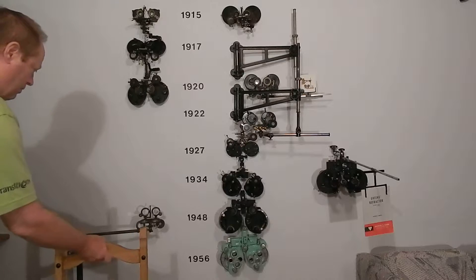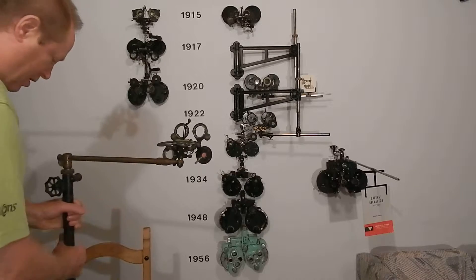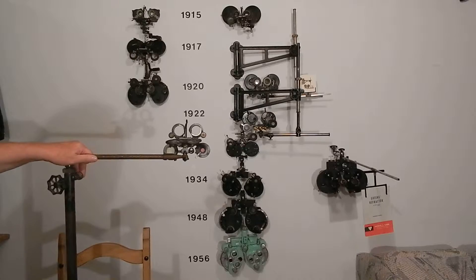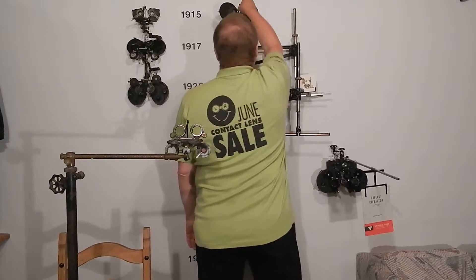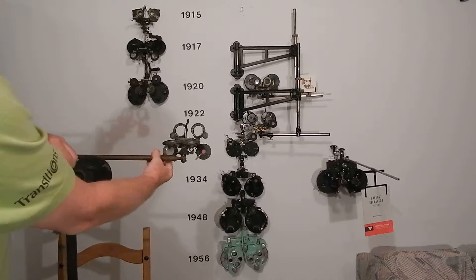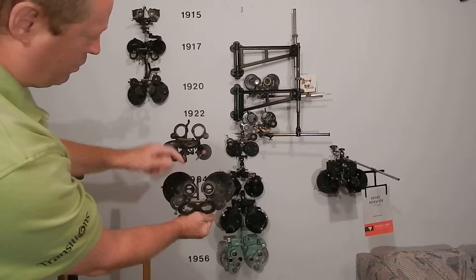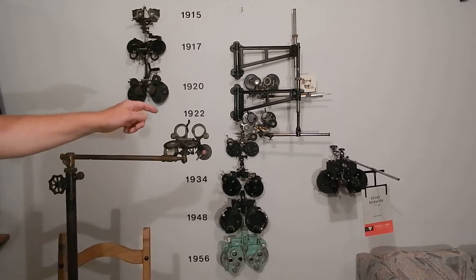Let me show you what that looks like. This is the 560 — it came out around the turn of the century, 1905–1906. Meyerowitz was selling these in his catalog in 1903. Comparing it to the 570: forehead rest, Stevens phorometer, Maddox rod, Risley prism — they're exactly the same. You can see: forehead rest, forehead rest, and you've even got the mechanism for inserting trial lenses — this is basically a trial frame.